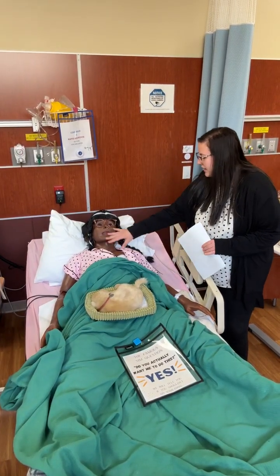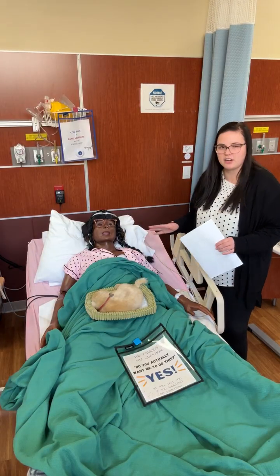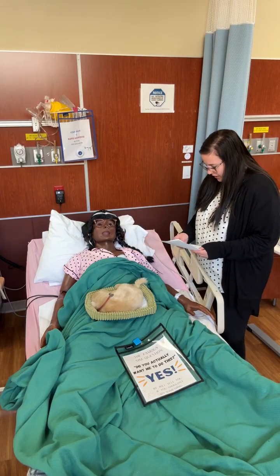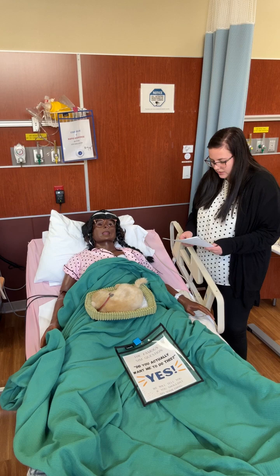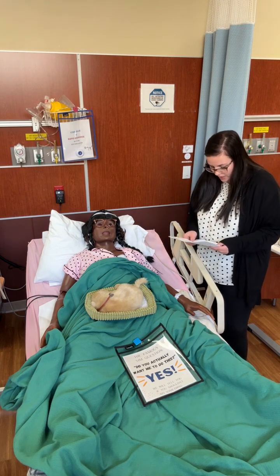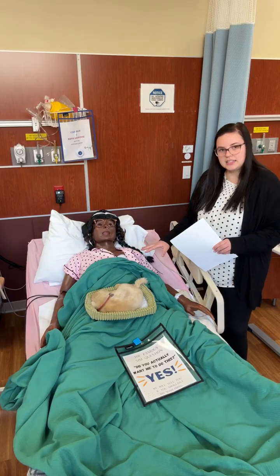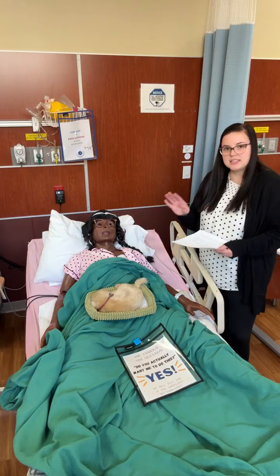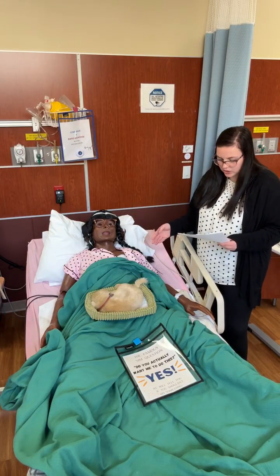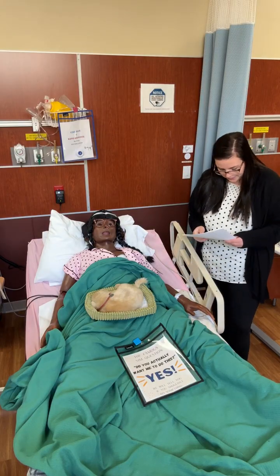She also doesn't have any lights or special effects to show any skin conditions or cyanosis, fever, anything like that. She does not have any chest rise when she is breathing. However, she does have lung sounds and a respiratory rate that you can listen and count using your stethoscope. Remember that when you are listening to your lung sounds, you're going to listen to the anterior lobes and confirm with the sim staff what you heard. If you want to hear the posterior lung sounds, you will just say, sim question, what are the posterior lung sounds? And then we will tell you.